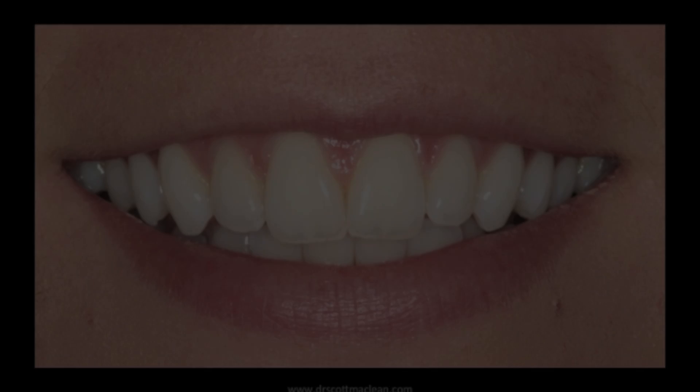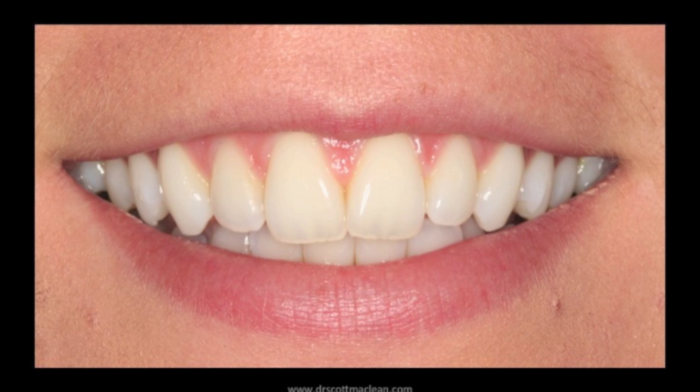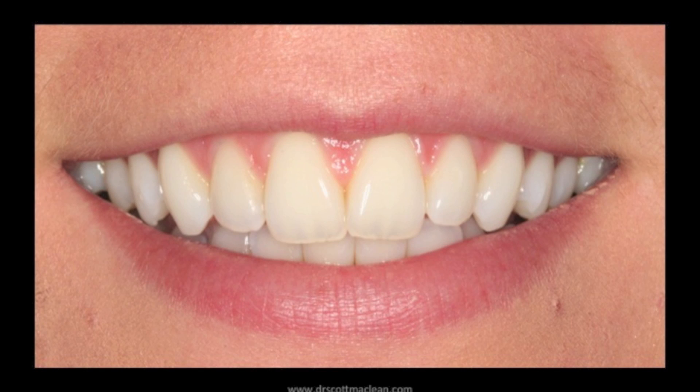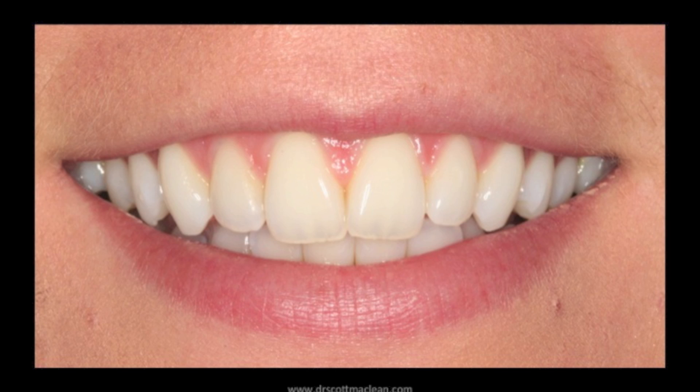When we look at her smile line we can see that we have to do a little bit extra in these cases. This case actually has long thin papilla and a little bit of a triangular style tooth.